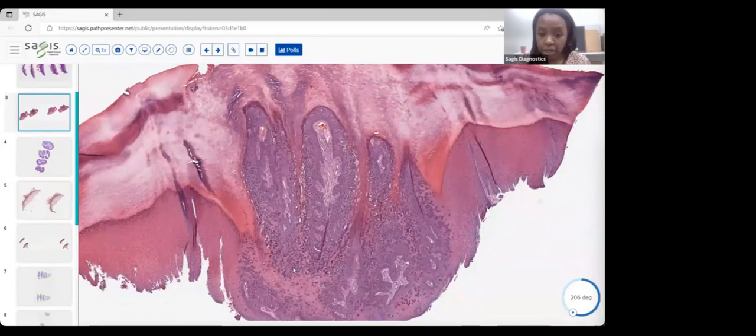All right, so still HPV, it just happens to be a wart pattern and appearance that is just very classic for these warts that occur on the feet. And they can be kind of interesting, you know, sometimes they can have melanin inside them, so they can be pigmented. But again, this is a characteristic appearance. Let's compare that now to the following entity.